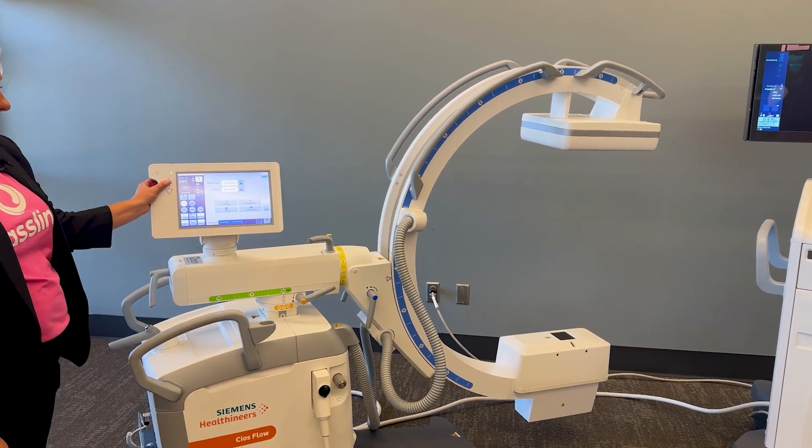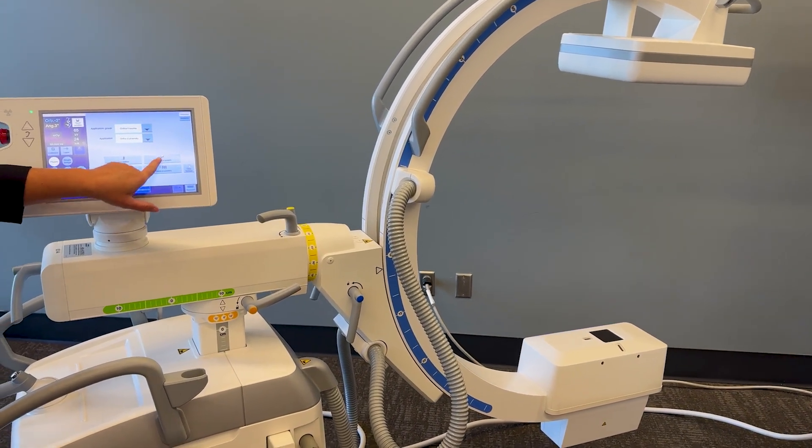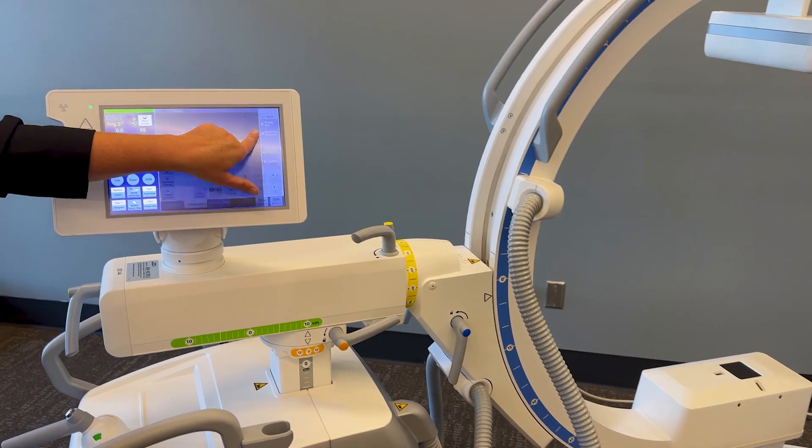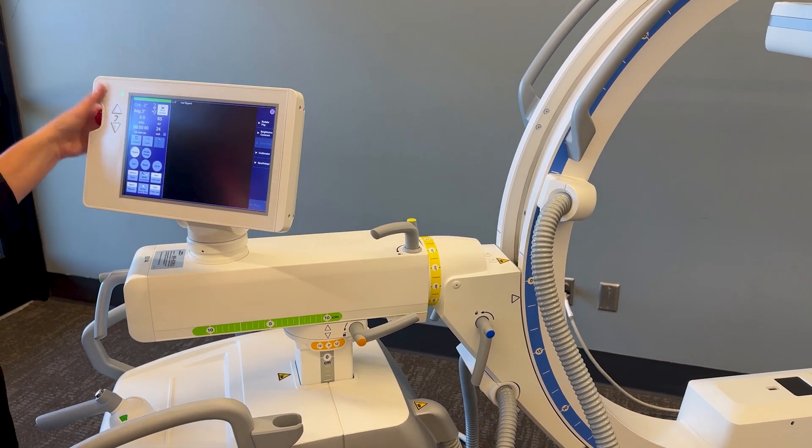You have a motorized up and down movement. You have the ability to see your image large on the touch screen.